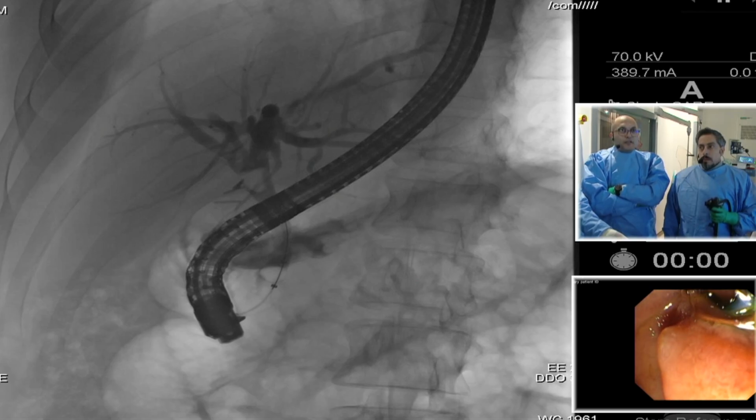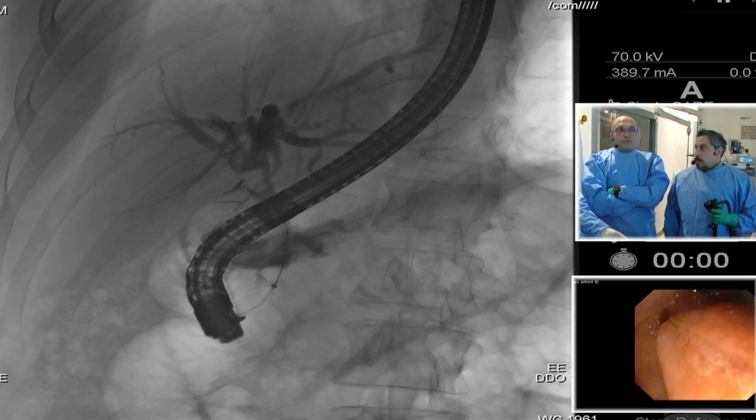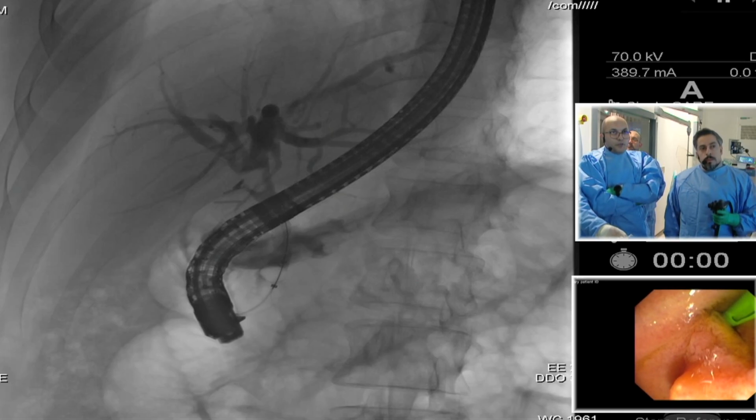As you mentioned, for this patient, 2 trials of EHL and still residual, very hard stone. So we expect that this stone would be very hard. We'll discuss laser lithotripsy, maybe as the last option for this patient before converting to a laparoscopic CBD exploration. So we wish we can help this patient with Dr. Bashir, inshallah, and we will shift to the laser probe.